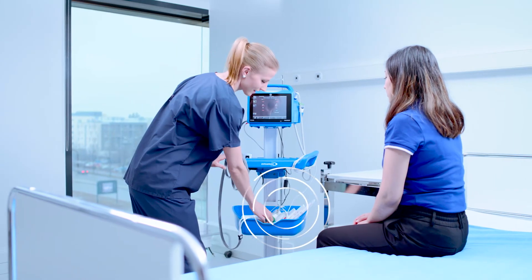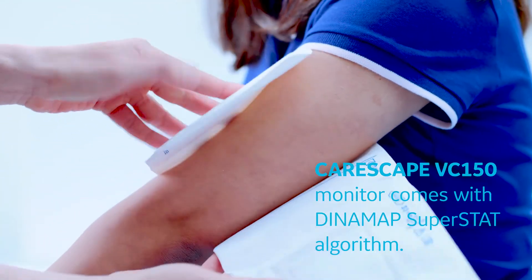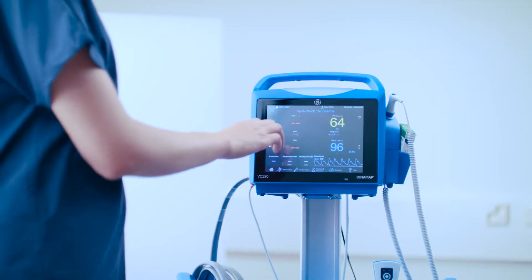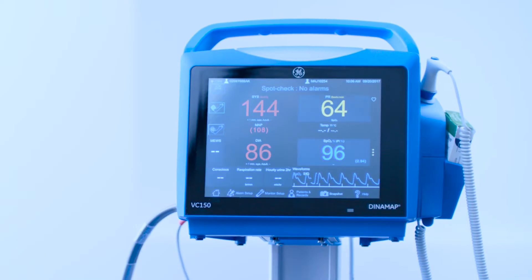Select a proper size cuff and hose for the patient and wrap it snugly around the patient's upper arm. Use of an incorrect cuff size may cause inaccurate blood pressure readings. Start your inflation modes either on spot check, cycle, or stat mode.